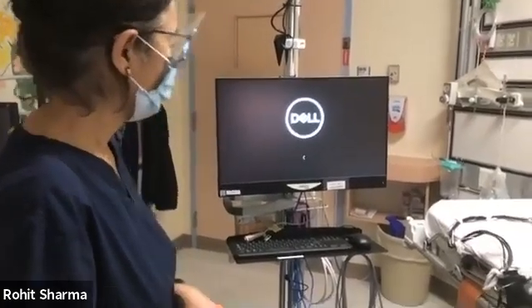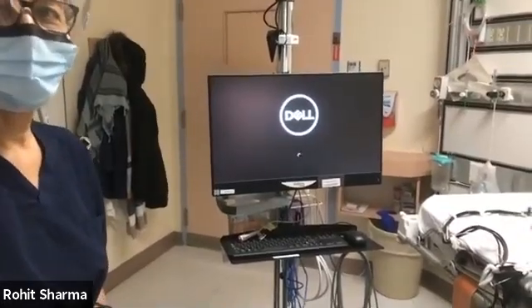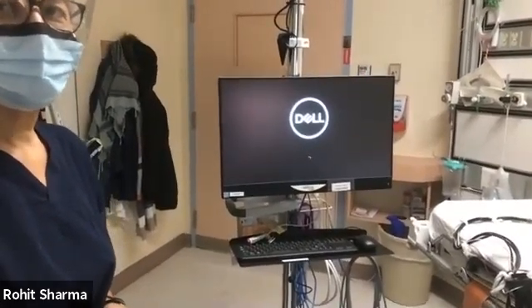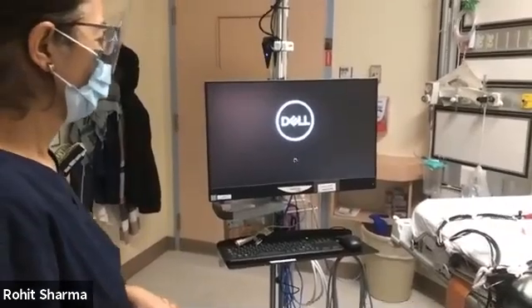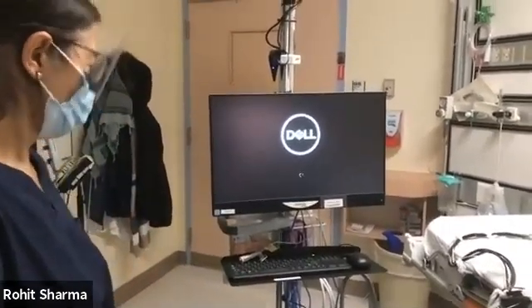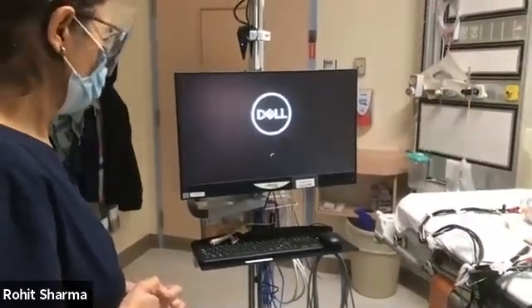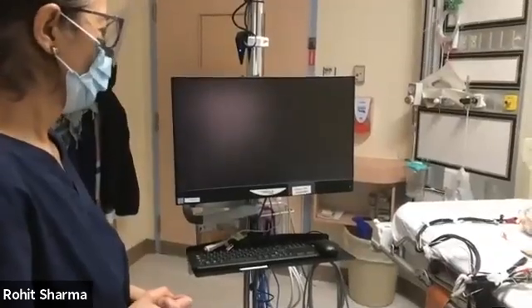It's also important to plug the network cable in first, because if the power cable goes in and the computer starts and the study starts automatically without it being plugged into the network, it will then record locally, and the neurophysiologist will not be able to be reviewing it.